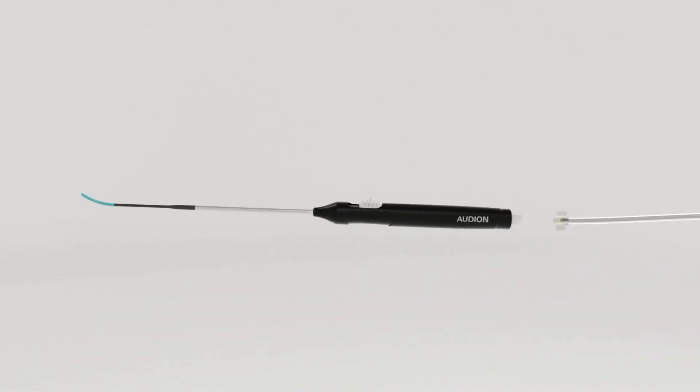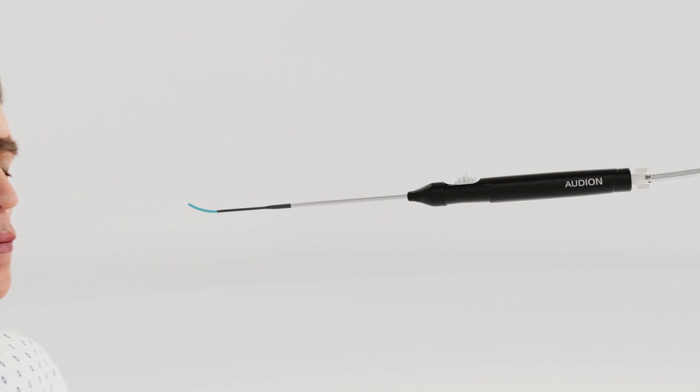Audion is Stryker's new Eustachian tube balloon dilation system, featuring FlexFeel technology.